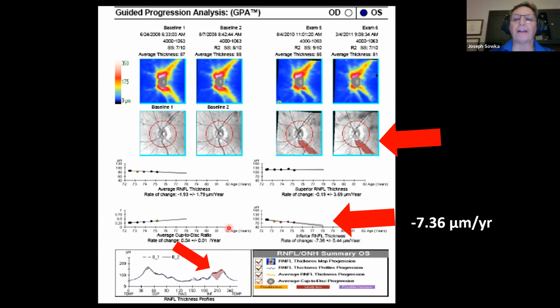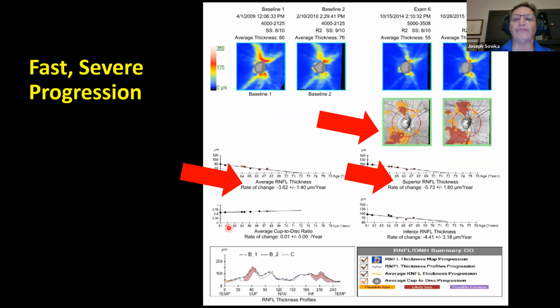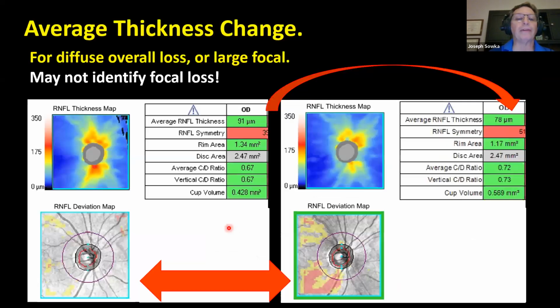And I think our final question here, Mike, is when utilizing GPA, when do you recommend resetting baseline? So for visual fields or for OCT? I think both. Yeah, both. Being able to change the baseline is an important tool to have.